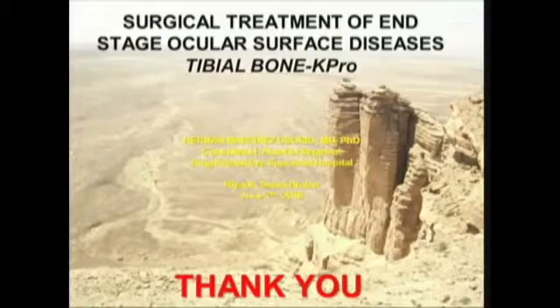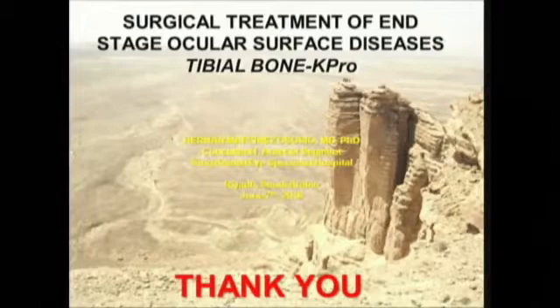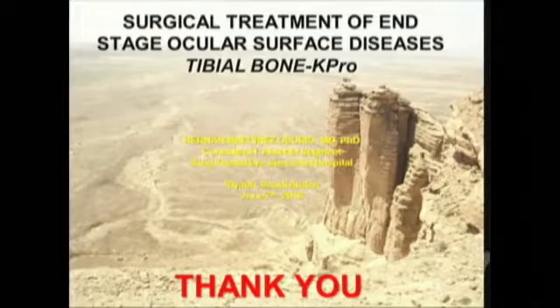Thank you, Dr. Osorio. We'll pass the microphone around and ask for other questions. It's a really exciting development. The question I would have for you is whether the development of retroprosthetic membrane and glaucoma is different between this and what was reported in the Boston KPRO. Do you think that's intrinsic to this design, or is it because with this surgery you always remove the lens and perform vitrectomy, whereas in Boston KPRO often we leave them pseudophakic?